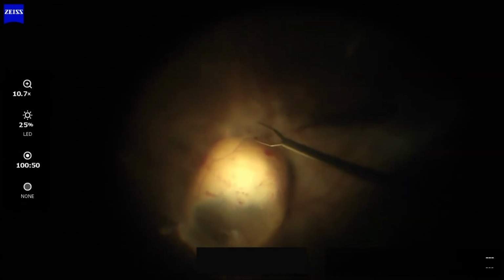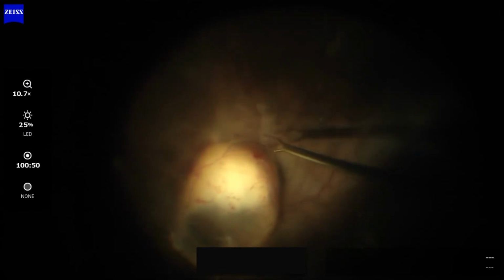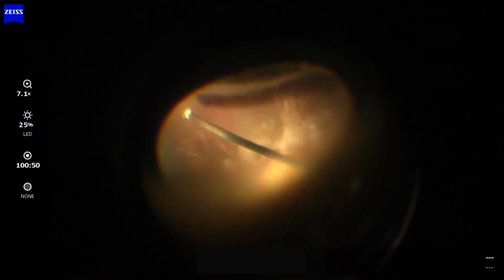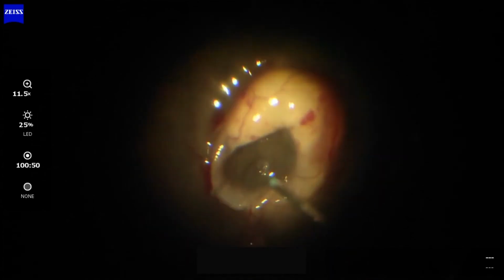We realized there was a thin sheet of vitreous left over the retina. It was removed using 25 GILM forceps. At the vitreous base, shaving was done all around using peripheral indentation. Finally, a fluid air exchange was done and the retina was attached. Endolaser was done around the area of retinotomy and around the fibrous tissue.